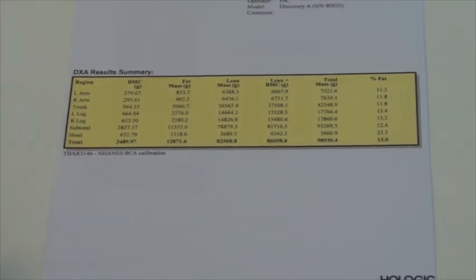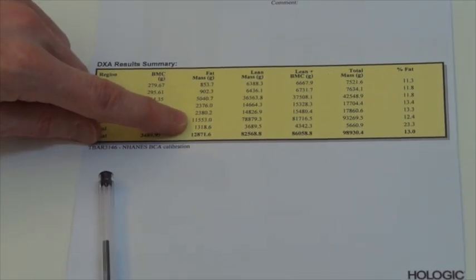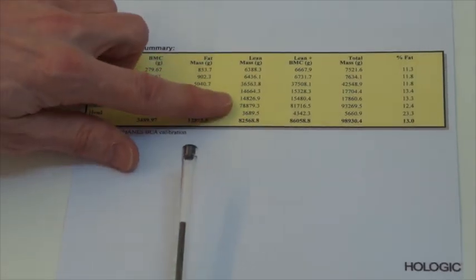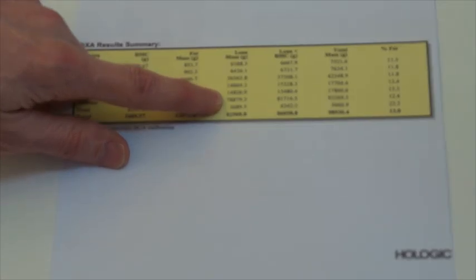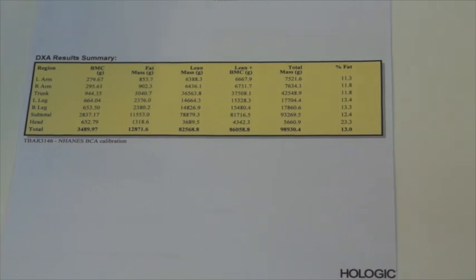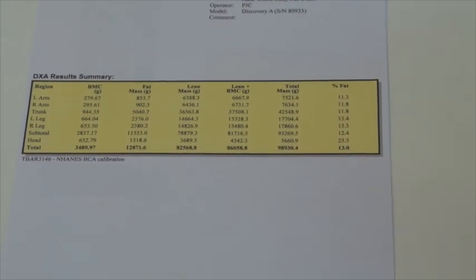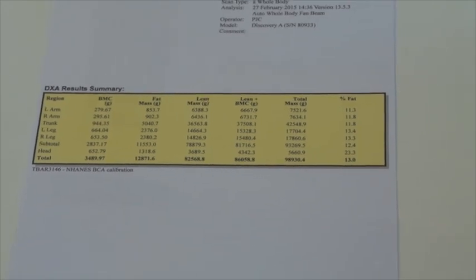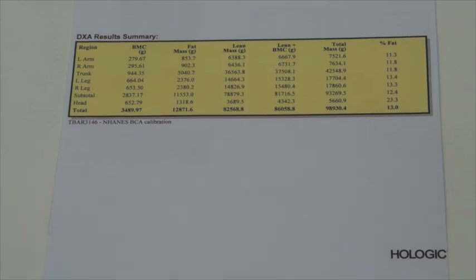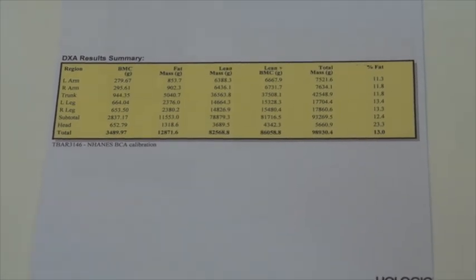We've already seen on page one your fat mass, reading to the subtotal line, 11.5 kilos. And now for the first time, we see your lean mass, again to the subtotal line: 78.879 kilos. Lean mass is not just muscle. It's all soft tissue that's not fat, so it does include internal organs, connective tissue, ligaments, etc. But any change in that number is a change in muscle, because we assume the organs and other tissue are constant.